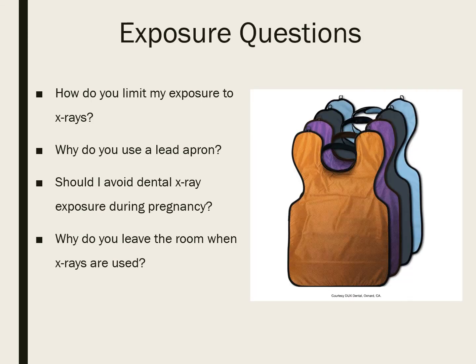Okay, so the first question about exposure is, how do you limit my exposure to x-rays? I don't think I've ever had a patient so eloquently say, how do you limit my exposure to x-rays? But anyway, we limit the amount of radiation that we give our patients by a couple of different things. Number one is that we only recommend radiographs when they are needed and that the prescribing dentist recommends them. It's custom based on the individual. Not every single patient who comes into your office is going to get an FMX, right? We're going to limit the x-rays as low as reasonably achievable, with ALARA.